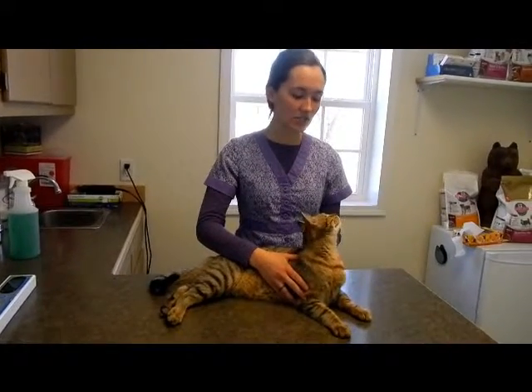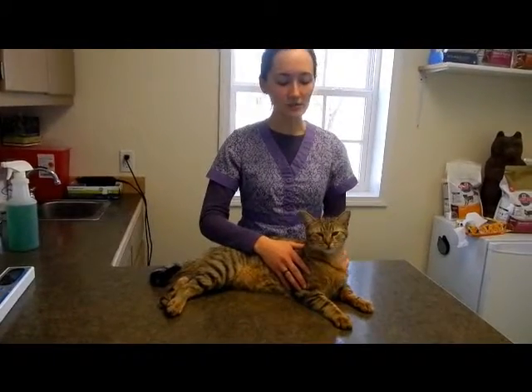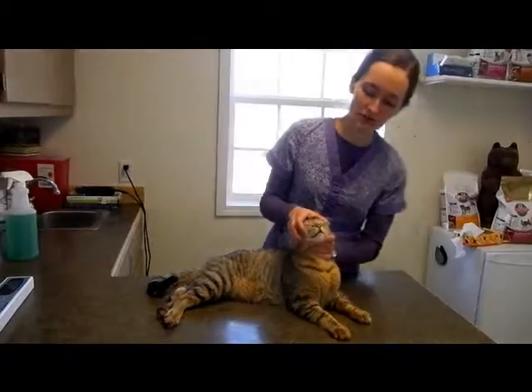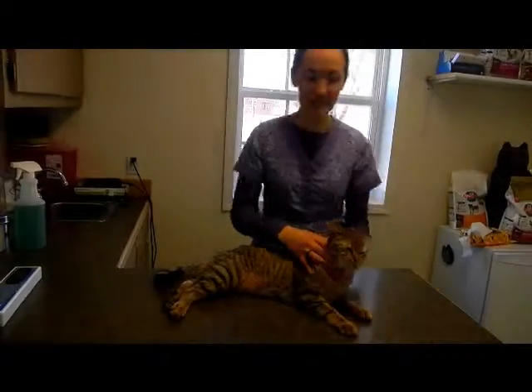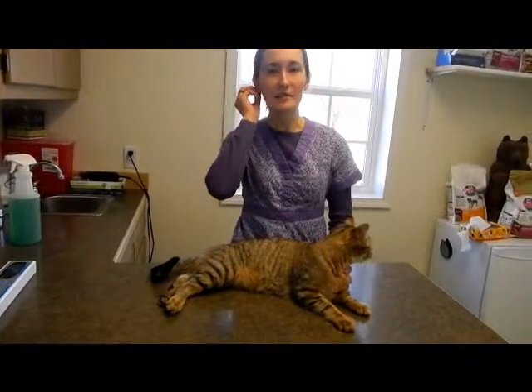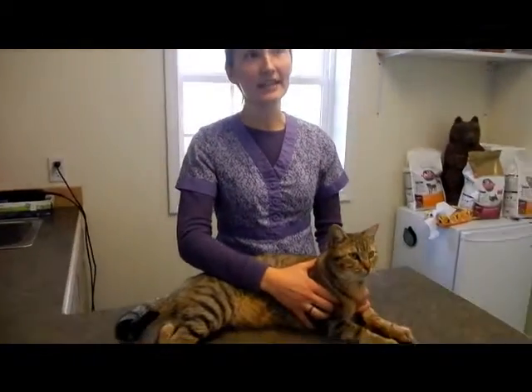Another one that's usually checked as the animal is going under anesthesia is the jaw tone. To pass the tube, you have to open the mouth, and so you can open the mouth and check the jaw tone and how light it is. Most animals will clamp their jaw shut and resist you until they're under an adequate plane of anesthesia. So that will also disappear at medium anesthesia.